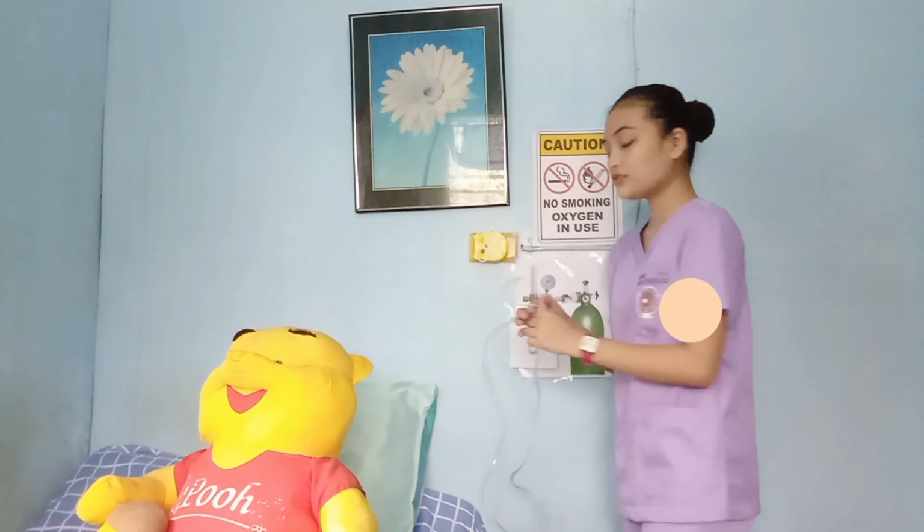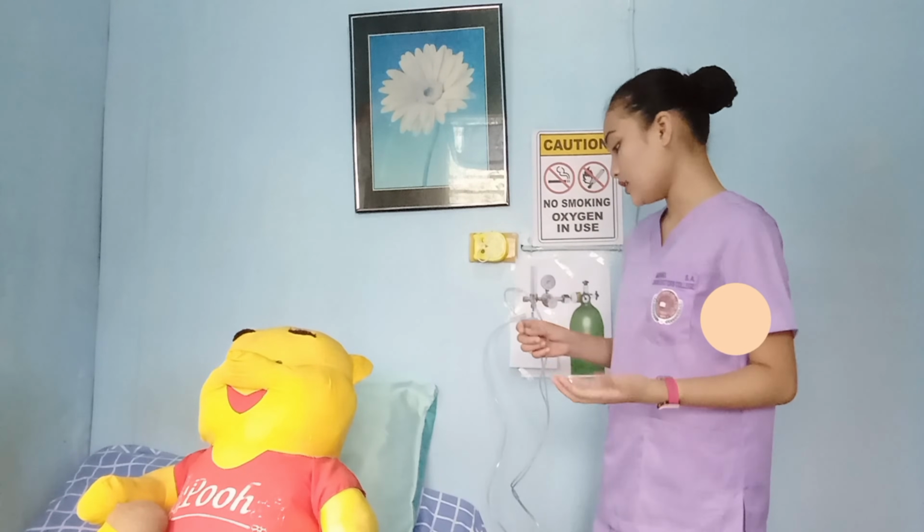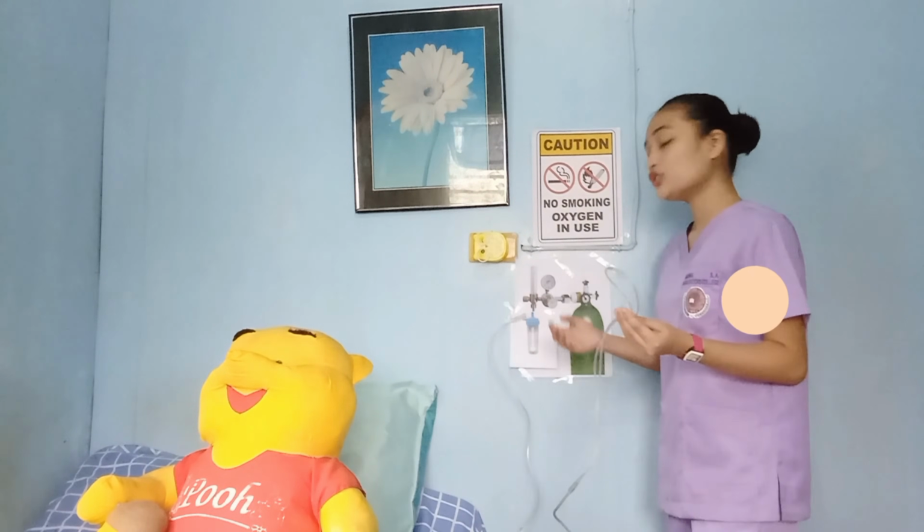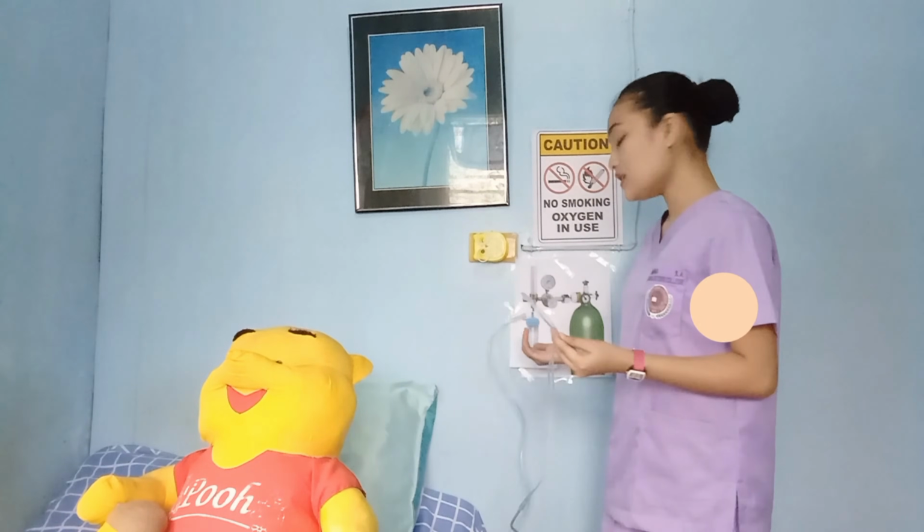Okay. After having everything connected, the next thing to do is to turn on the oxygen and ensure proper functioning. The oxygen must be flowing freely through the tubes. There should be no kinks in the tubing, the connections should be airtight, and there should be bubbles appearing in the humidifier as the oxygen flows through.